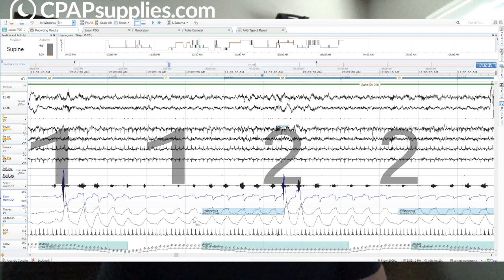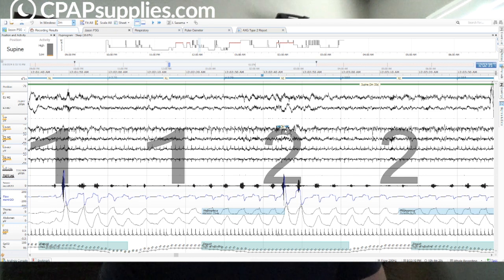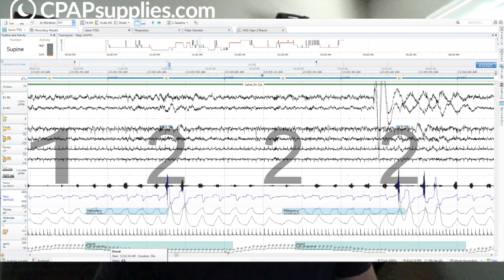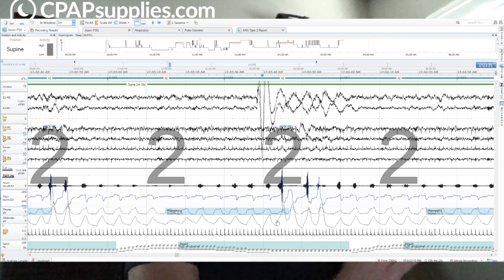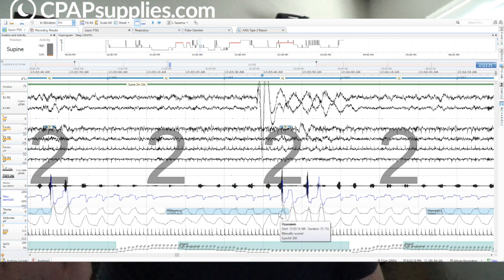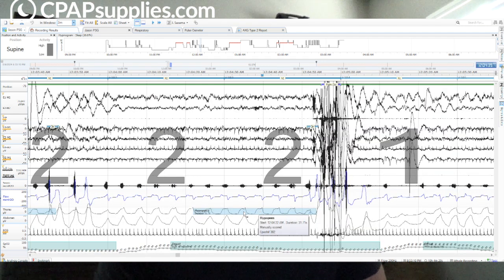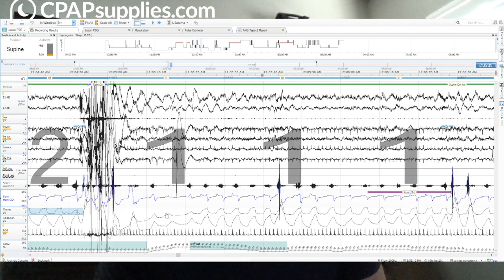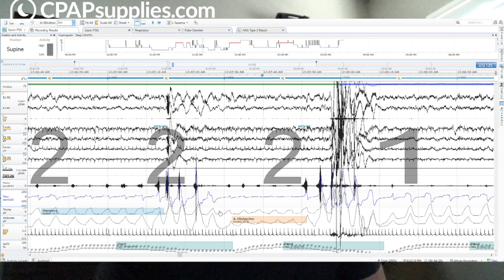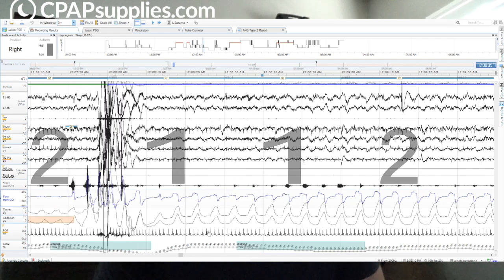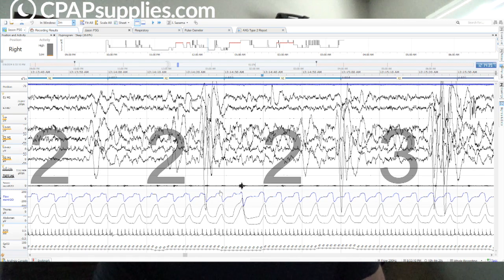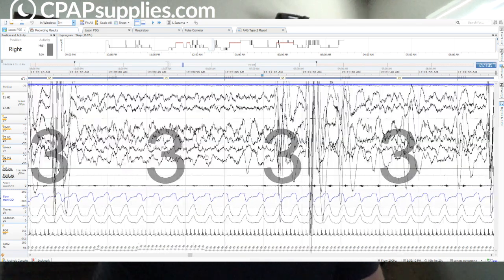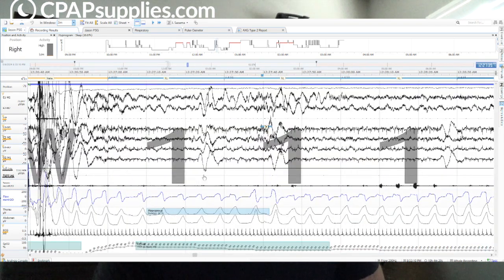Okay, so sleep-wake junk has been handled. But here's what I wanted to focus on. So they're on their side for a lot of this and there's really nothing. Now they're on their back and now all of a sudden, we see a ton of obstructive events that are increasing in severity, still causing awakenings. The difference being they're now categorized as hypopneas because we have a bigger oxygen desaturation. It's literally the only difference. Before on their side, we're still seeing disruption, just to a lesser degree. It would be seen as less severe if you're going by Medicare standards. Okay, I want to try to keep this video short, so let me zoom ahead faster. So all on their back, much worse. Obstructive hypopnea, obstructive apnea. First one we've seen, big flat line, big massive awakening, big snorts, gasping awake. Blood oxygen desaturations of like 8% right here. And then they're on their side and then everything looks good again. Snoring decreases, breathing looks better, arousals much less, into delta sleep, slow wave sleep.